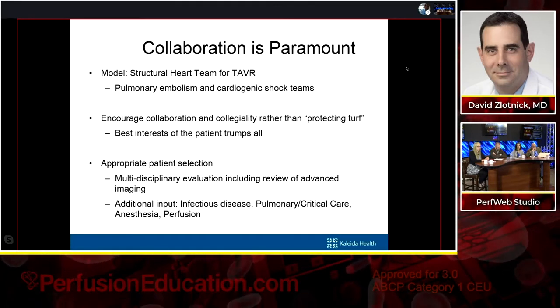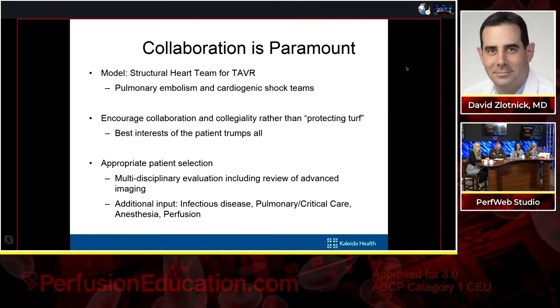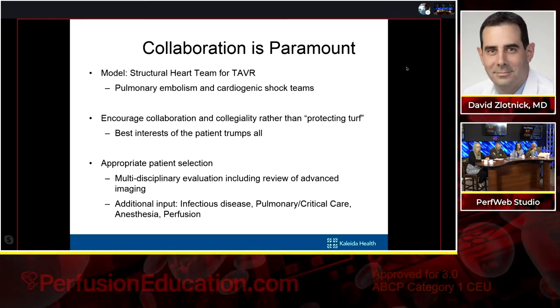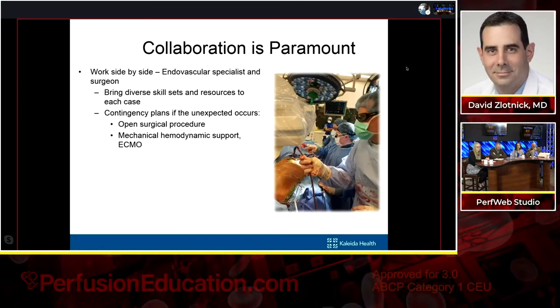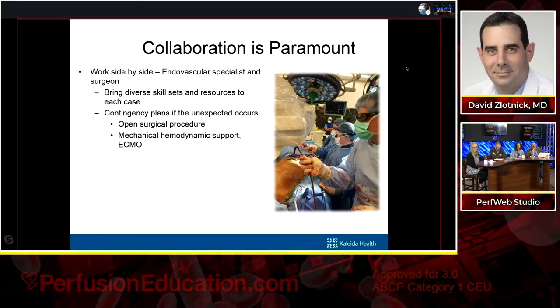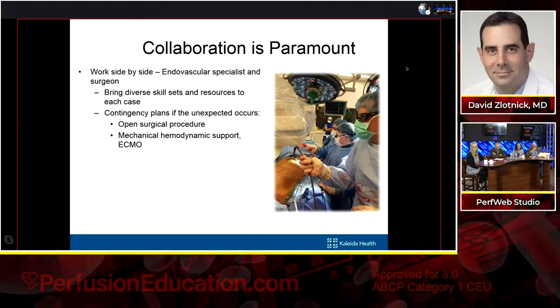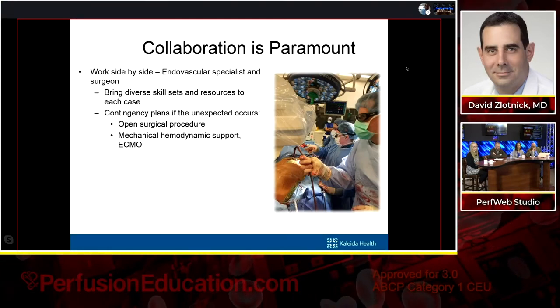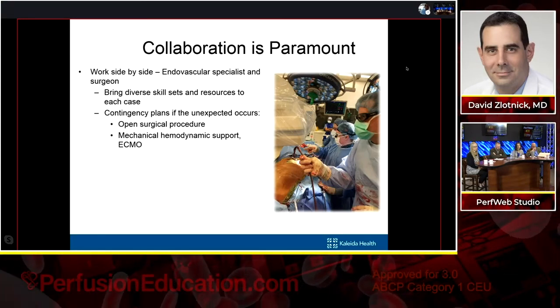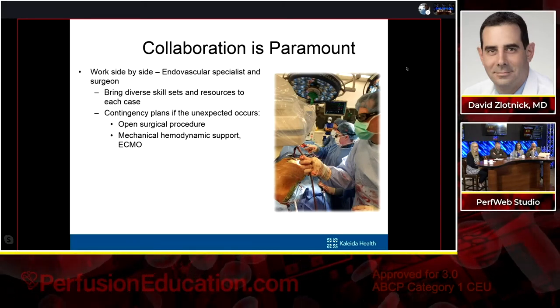For some of the high-risk cases, we all get together beforehand and have a pre-procedural huddle where we think about all the contingency plans that we need to consider in this patient. That's why it's nice for me as an endovascular specialist to be working side by side with one of our cardiothoracic surgeons, because we can bring a diverse skill set and resources to each case. And we have the ability to make a contingency plan if the unexpected occurs. Are we going to convert this to an open surgical procedure? Are we going to be able to support this patient with mechanical hemodynamic support and ECMO?